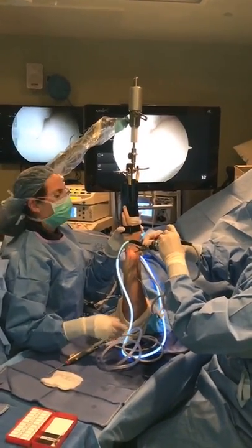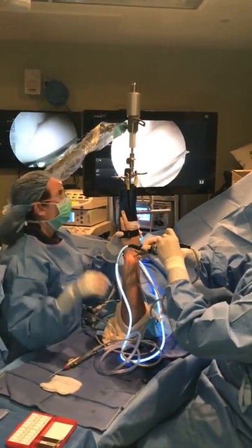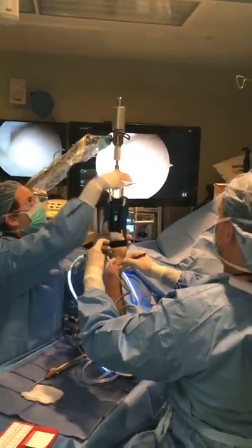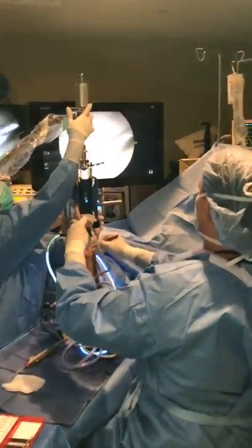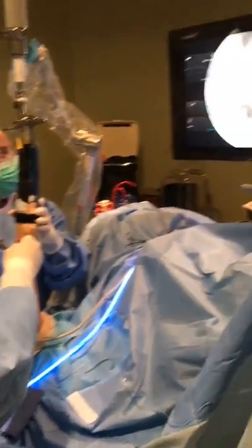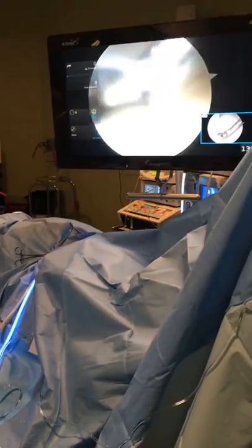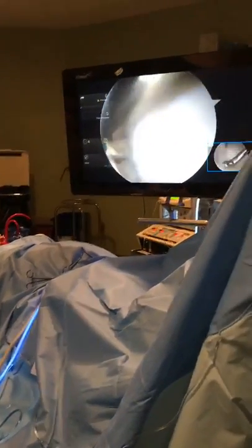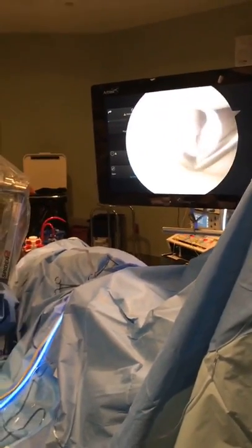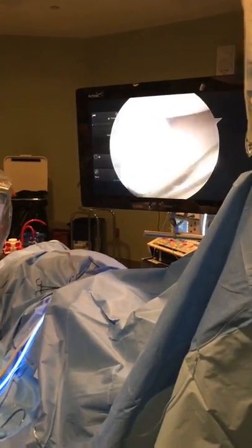So, Kate, let's supinate them a little bit. Now we're going to heal this. Okay, there we go. We're going to do this with the wrist in a palm-up position of supination. I will not bore you with the biomechanical reasons for that, but here's the tear, see? My probe falls right in there. And we're going to repair this to the capsule.